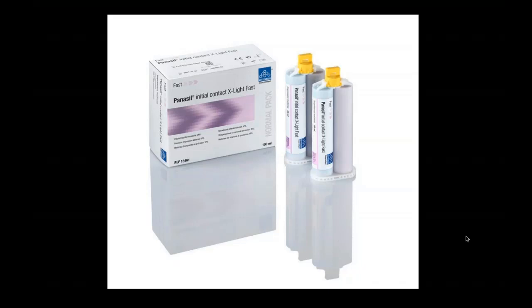Now, I know we just talked about using a putty, but that's just for diagnostic models. It's not crown and bridge. It's not the accuracy of the impression that is needed for crown and bridge. So I've never done a wash with that. Another question: it seems like the putty wash would be more accurate than the Silginat. Is that true? It can be true.